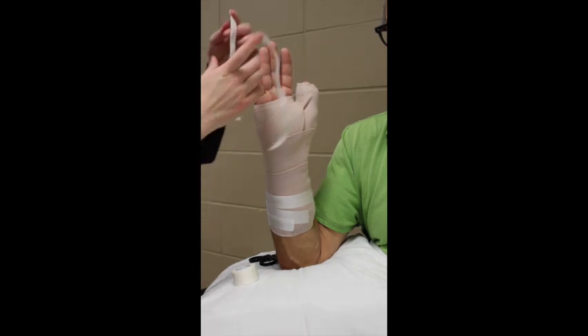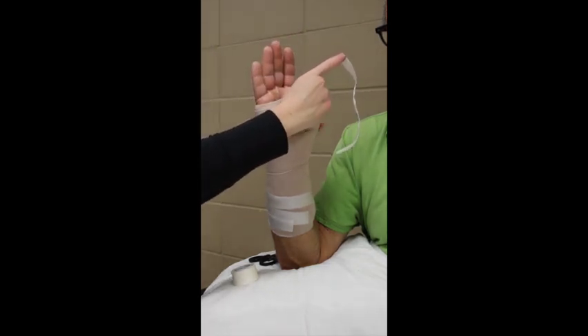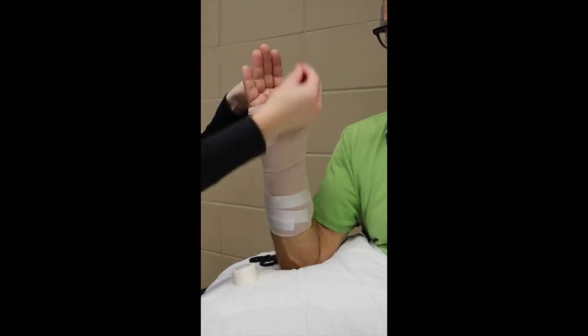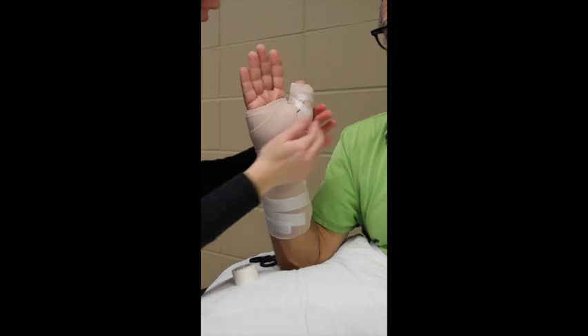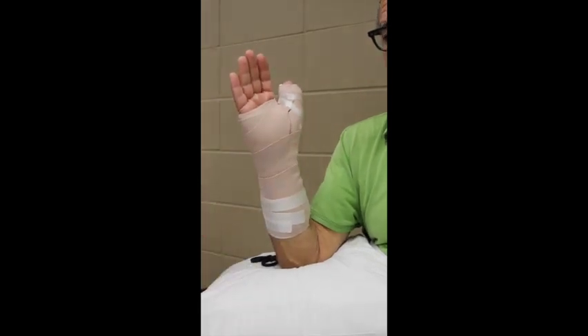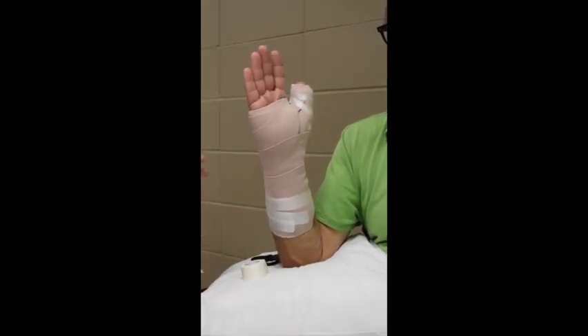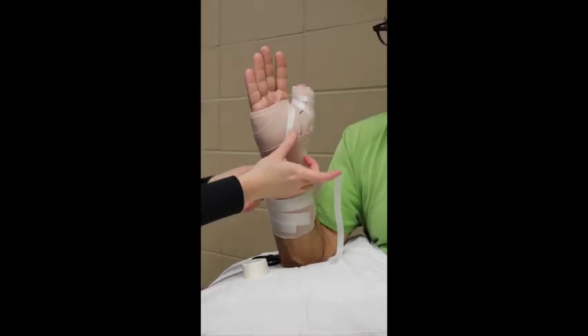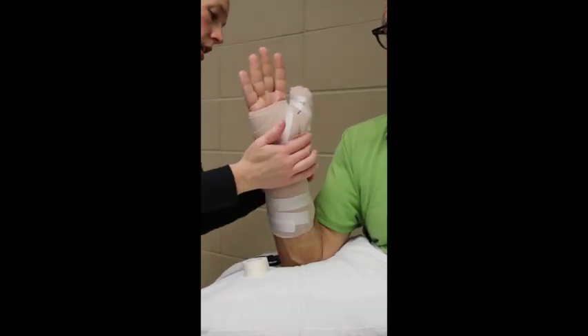Then I take some pieces of tape and make half strips to go around the thumb and hold any edges in, holding the ace bandage around the thumb and palm. I call this tape art — it usually makes the patient smile. This splint would be considered a thumb IP joint free, as the tip of the thumb is able to move a little in the confines of the splint.